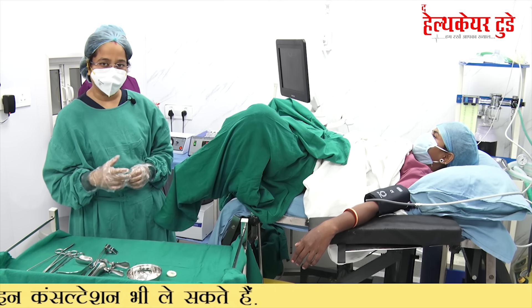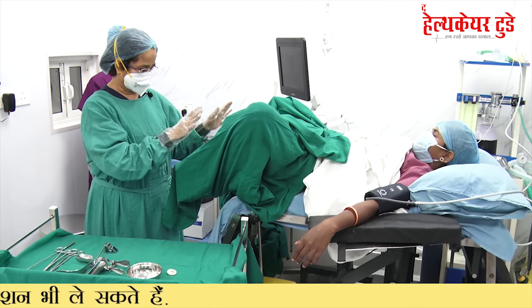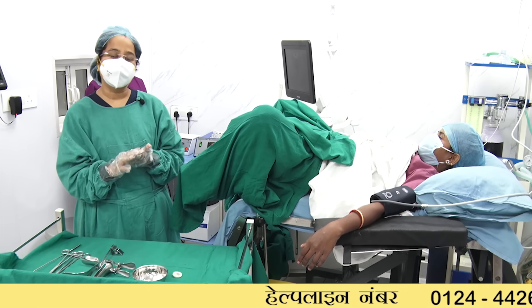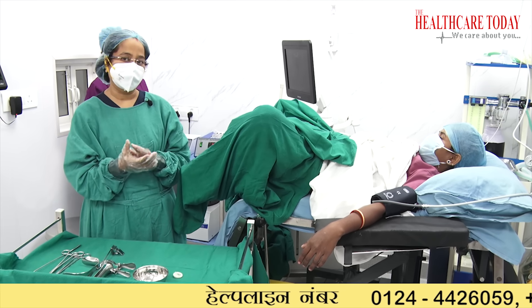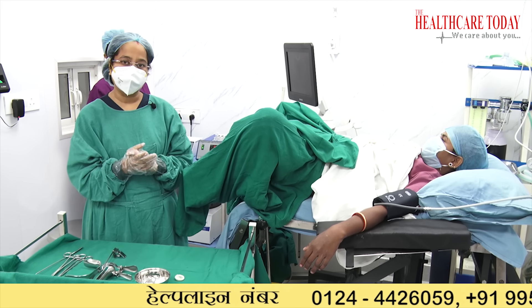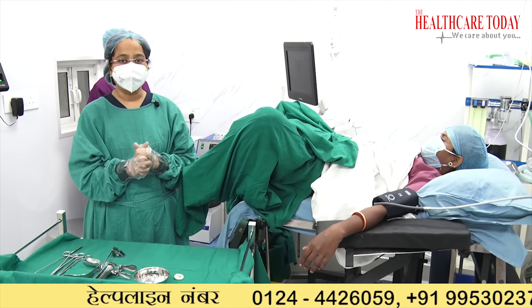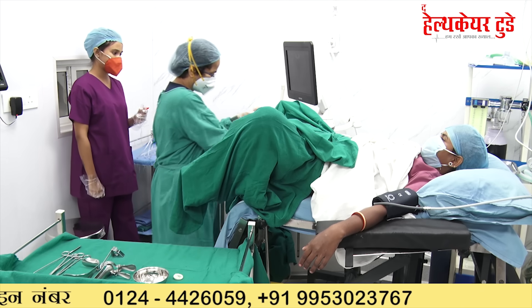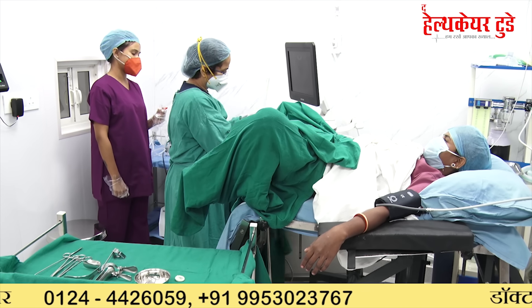You can see that we have proper sterile surgical gowns and sterile gloves. This is an ultrasound machine and this is an ultrasound probe.